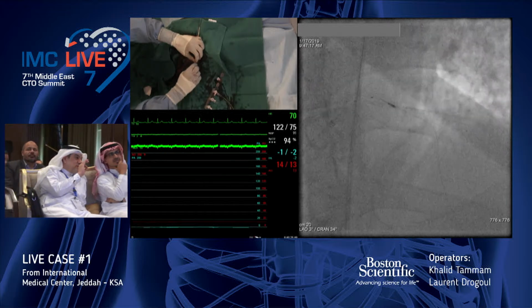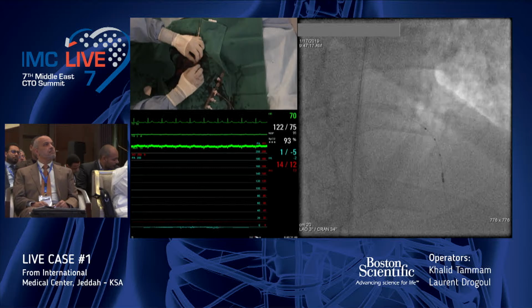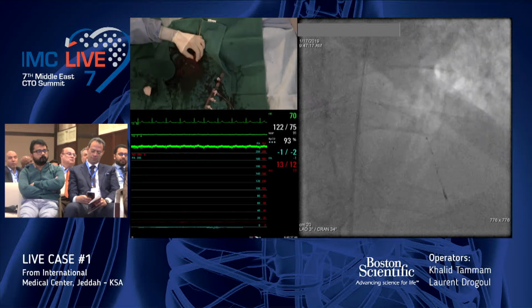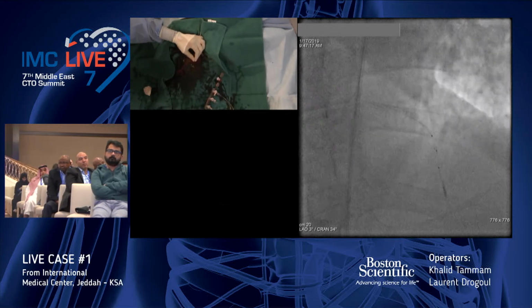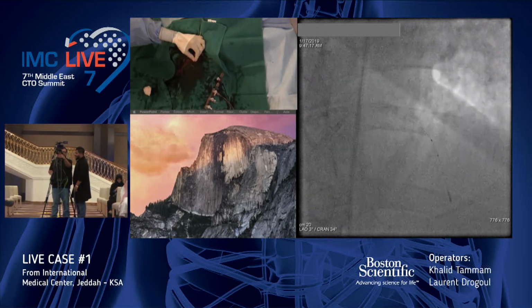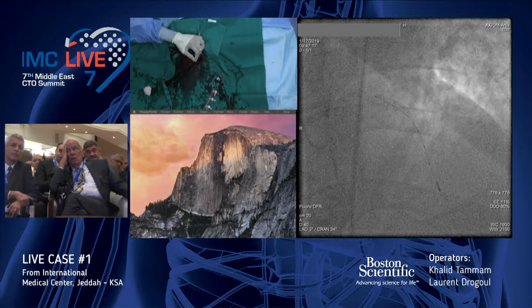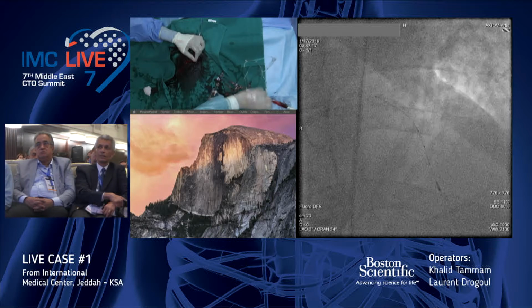So maybe can we have the IVUS screen now, please? Can you switch to IVUS, please? So we have Alex Kipri with us now, Stéphane Crier, and he will comment on the IVUS. It's always a pleasure because for me he is one of the best IVUS commentators, and he is very educational.